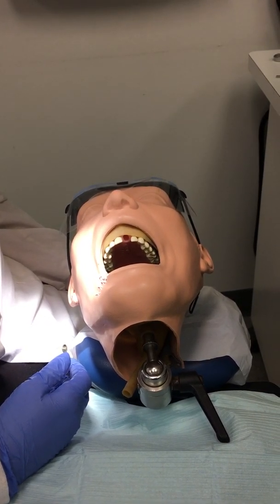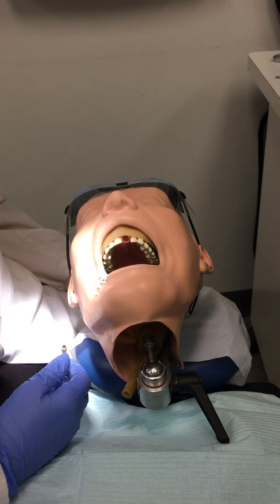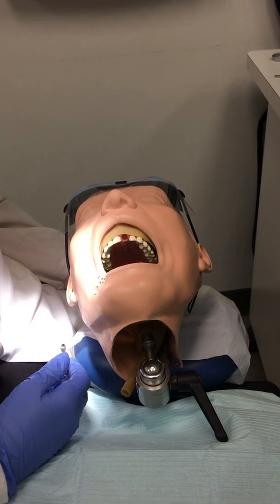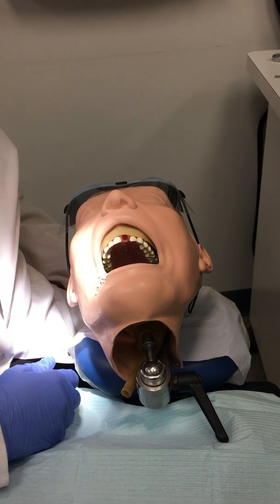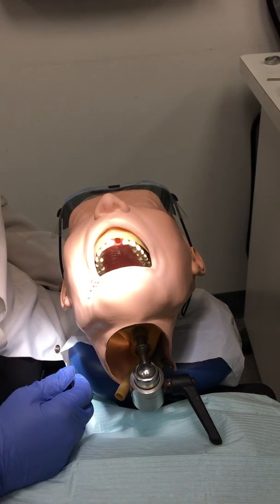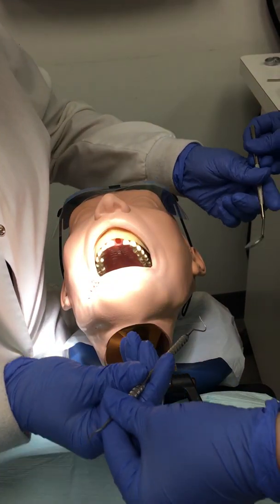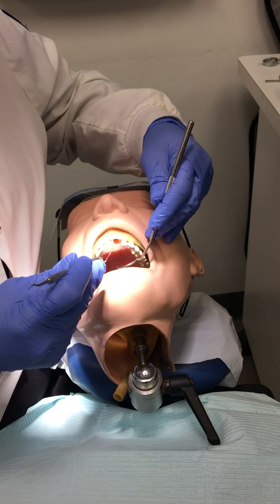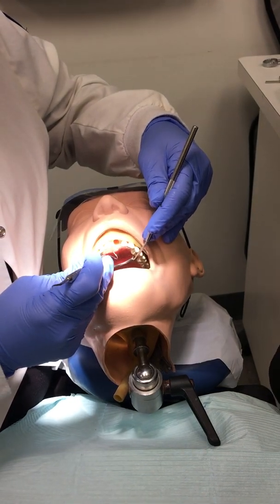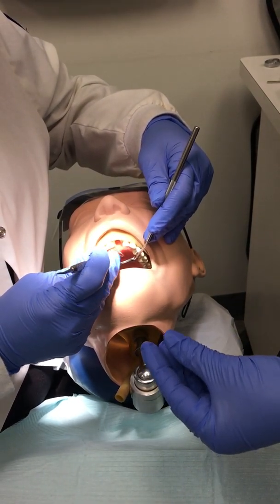Be sure to have the initial PA on the view box, or take a PA if needed. The doctor will come in, and you need to transfer the mouth mirror and explorer to the doctor simultaneously so the doctor can examine the tooth. Then retrieve the mirror and explorer.